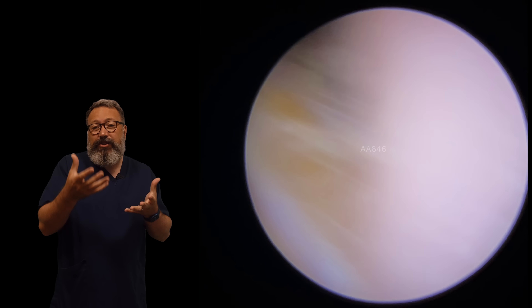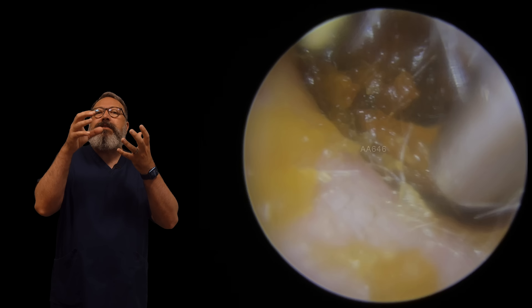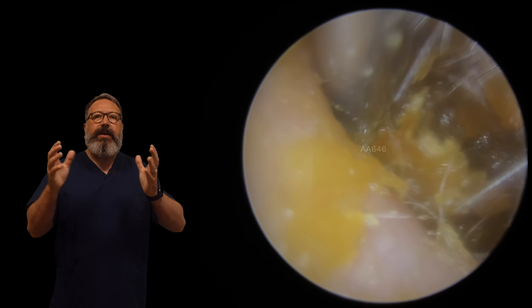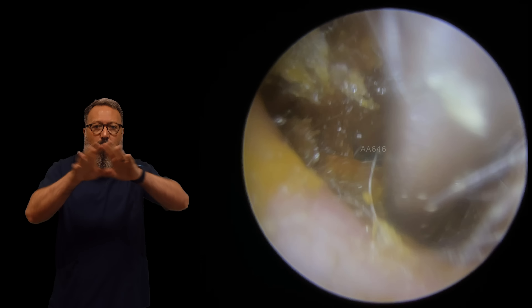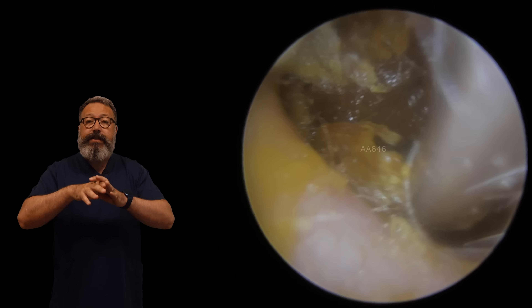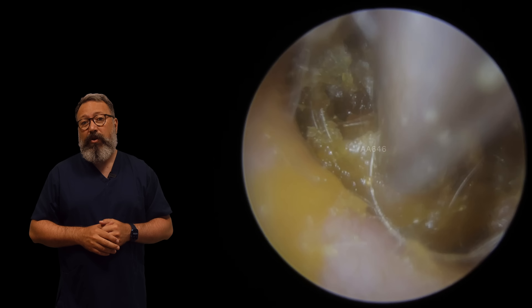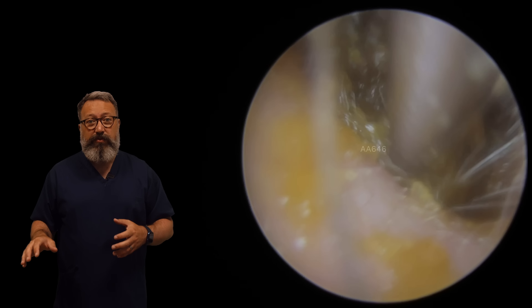You can see it just coming away there. But when we were using the suction, what was happening is as we were going down for the suction grip, the skin that's a little bit looser will naturally want to fold in front of the suction. And when it does that, it blocks you getting to the wax behind. So you can see what I'm concentrating on here is getting rid of all those skin layers.